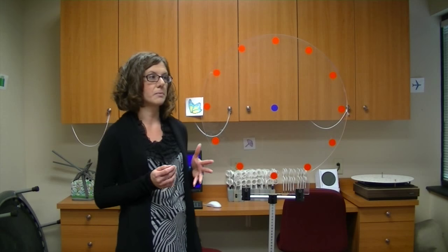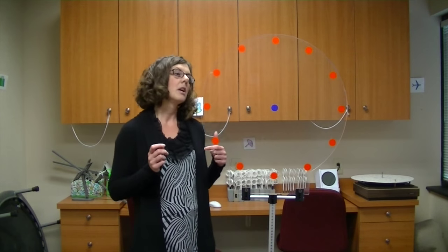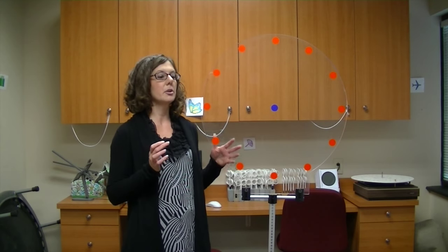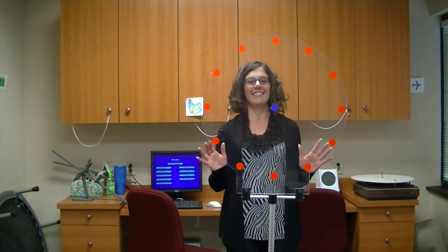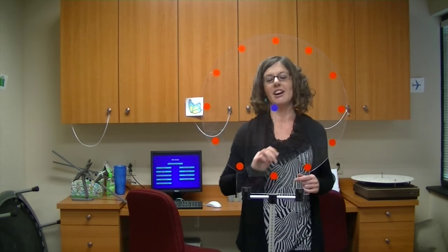And today I'm going to concentrate just a smidge on the sports aspect of it. So when we're doing this activity, the person has to stand back behind the instrument, kind of like this. No, but they're going to stand back behind there, and they're going to stare right in the center at the blue dot.